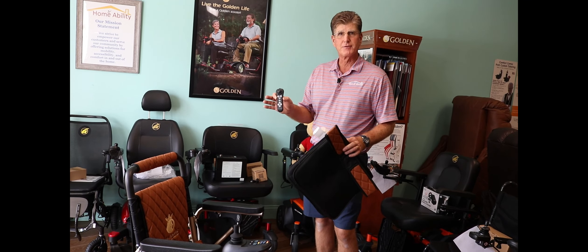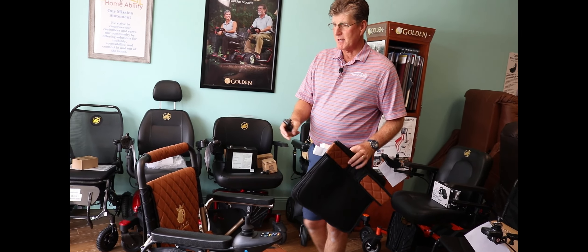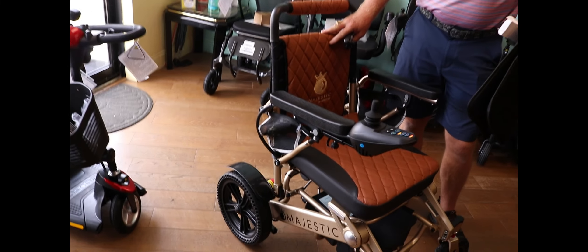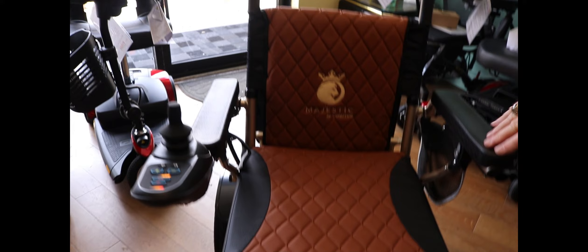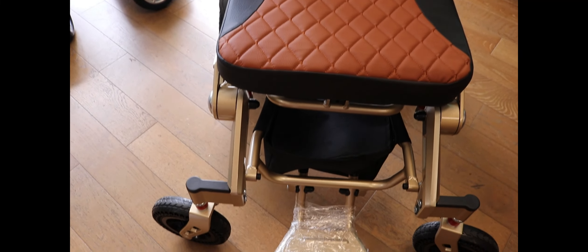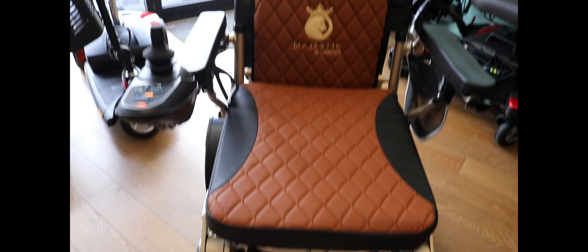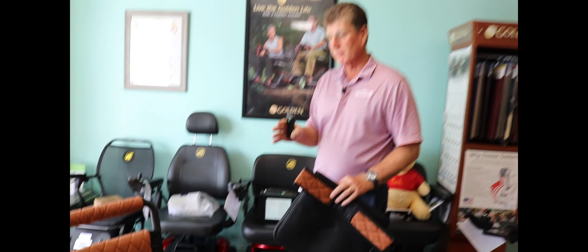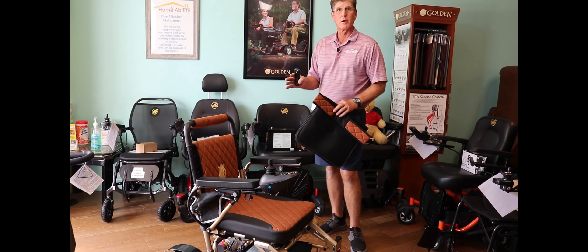I'm not sure I've seen anything in the market that's even close to this. You can customize the upholstery — the shipment we received today has various colors of upholstery as well as the frame. This is going to sell from our store in the mid two-thousands; I haven't got the exact price yet, but the value for the benefits seems to be a great equation.